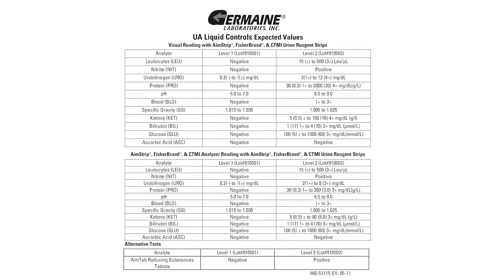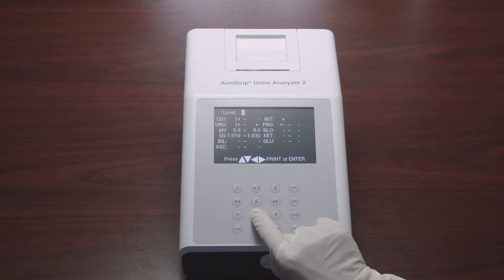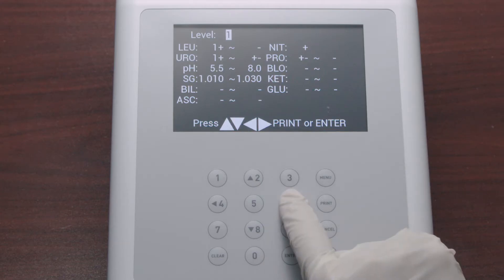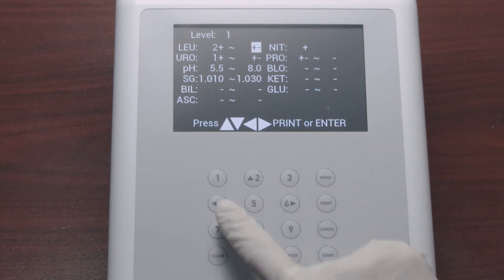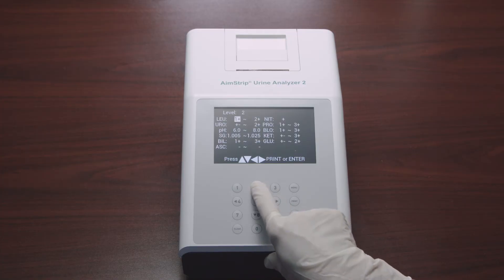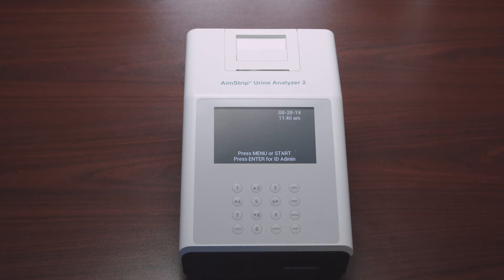The QC values are located on the package insert that comes with your liquid controls. When the cursor is on Level 1 or Level 2, press the up or down arrow to navigate between the level screens. Press the left or right arrow to move to the digit to be changed, and press up or down to increase or decrease the value. Change each analyte QC value in this manner until the screen values match the expected values insert. Once done, press Enter to save changes and exit, or press Print to print the current values.